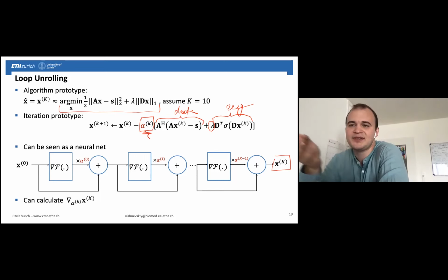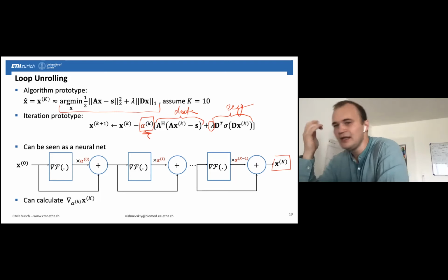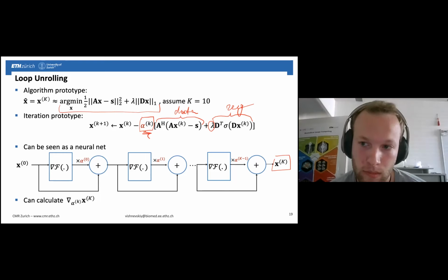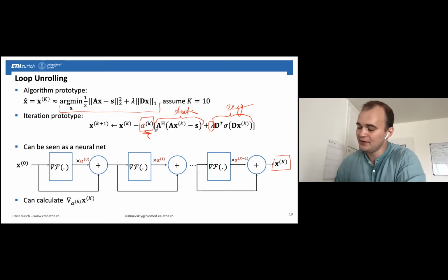But there can be some systematic errors in a scanner due to a lot of different artifacts. However, we cannot learn them because we don't have paired training data from the scanner usually. It's very hard to design such an experiment. And therefore, we cannot learn too much more about the image synthesis model here.